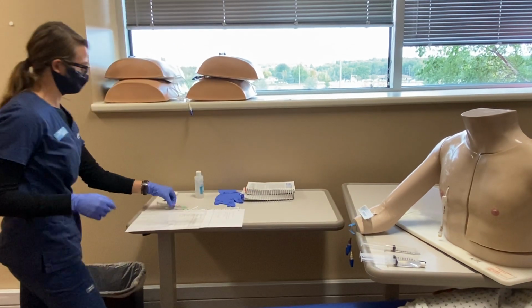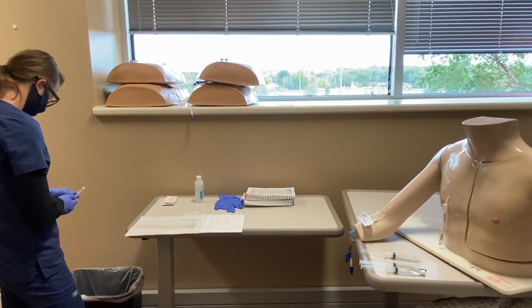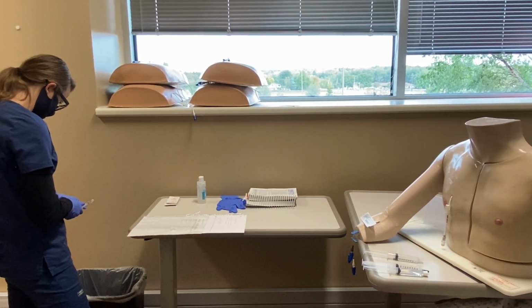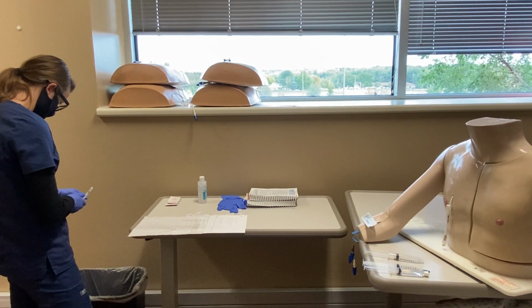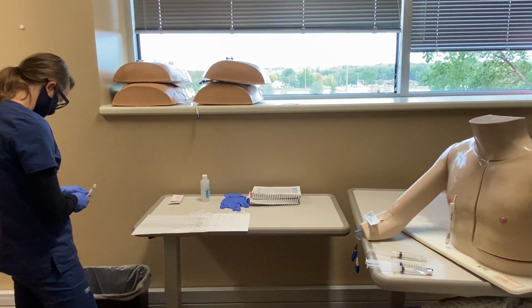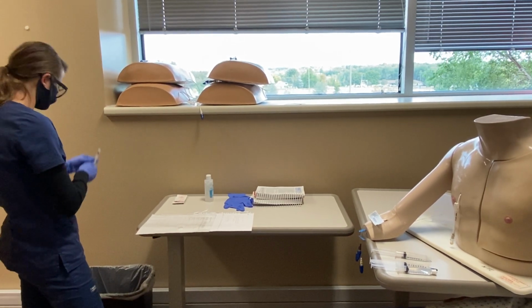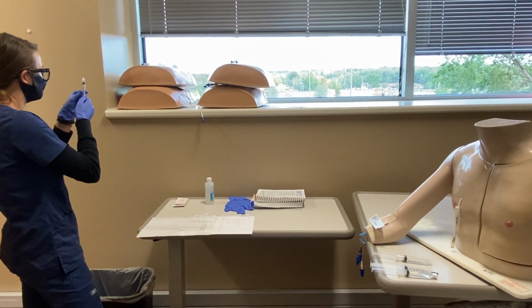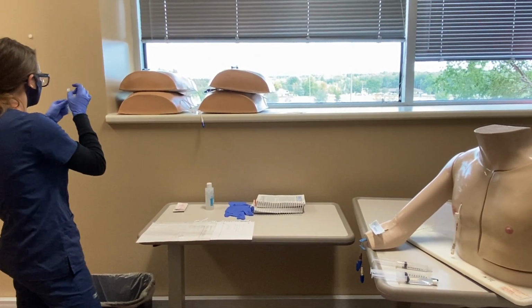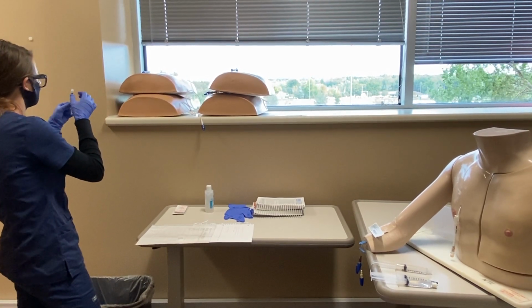Alright, I'm going to get dose accurate. Making sure that there's no air bubbles.